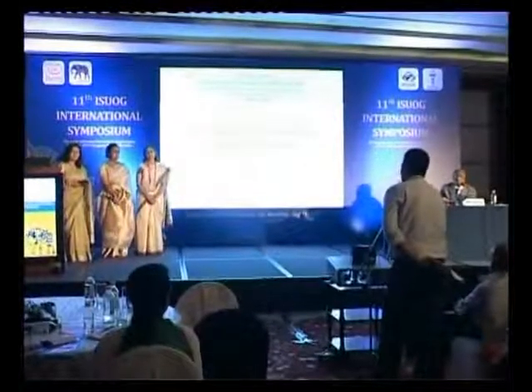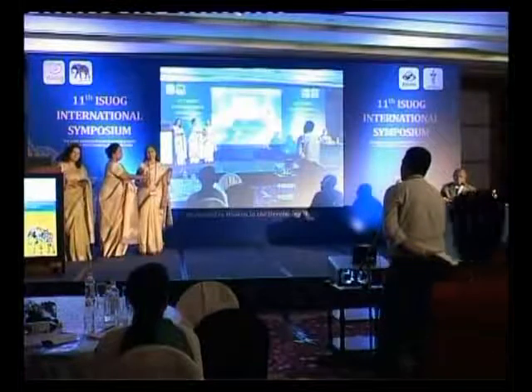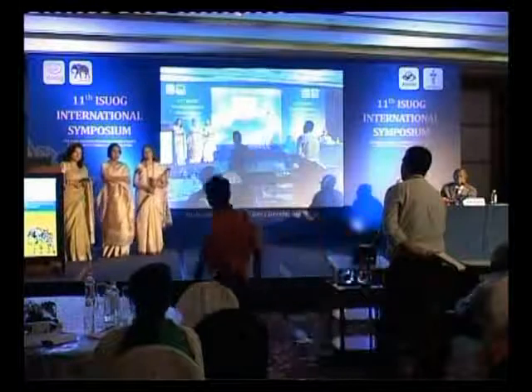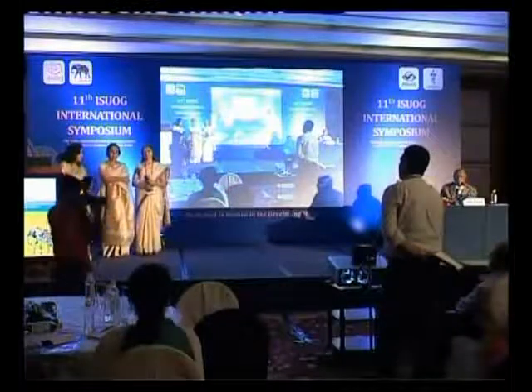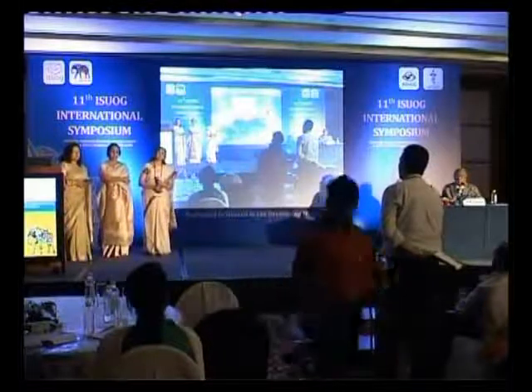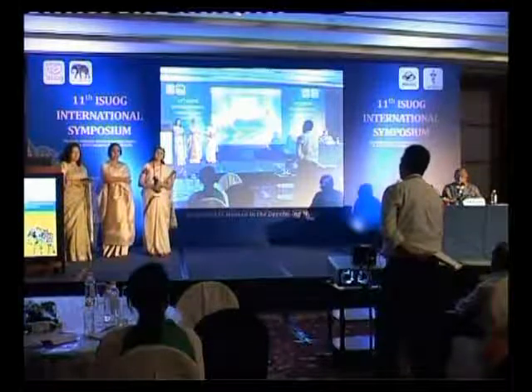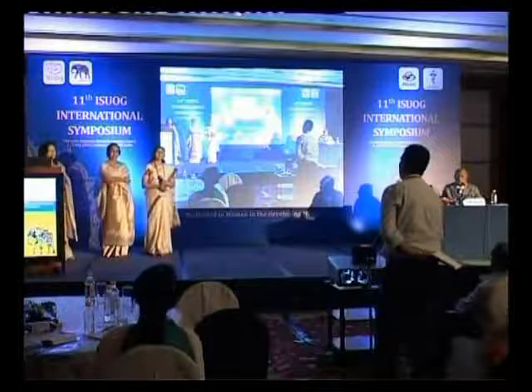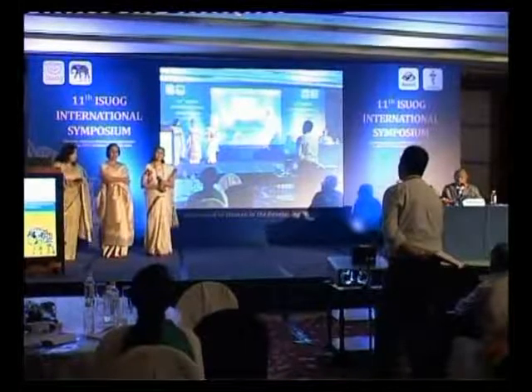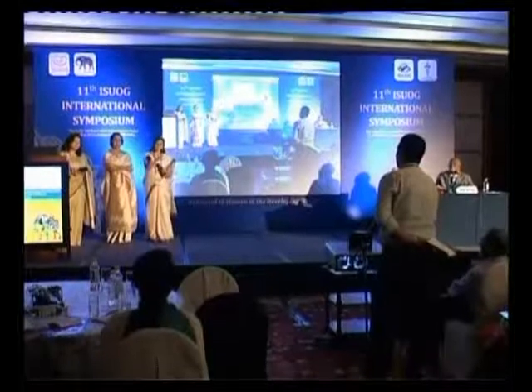Good morning, ma'am. My question is, I fail to understand why there is still so much emphasis on uterine artery PI in the endometrial receptivity scan, when we know that the uterine artery gives a global supply to the uterus, of which the major component is the myometrium and a very small component is the endometrium. Once we are already looking at the subendometrial and endometrial flow, why not just stick to that and avoid taking the uterine artery PI for the sake of time, especially since any fibroid or adenomyosis is going to alter the PI altogether.